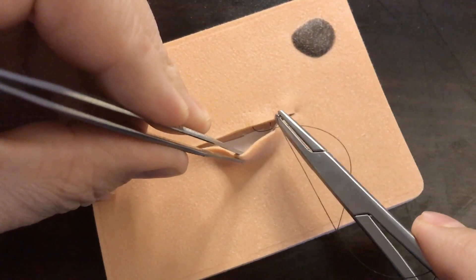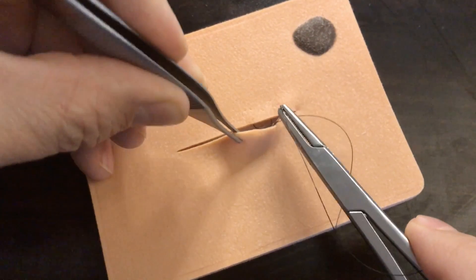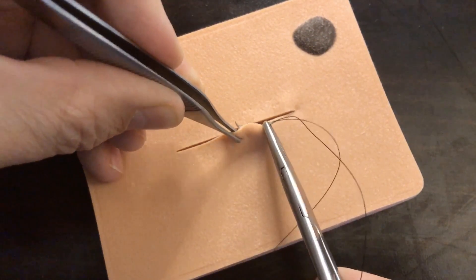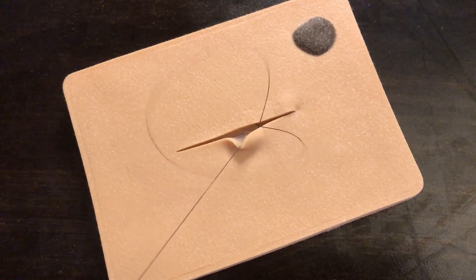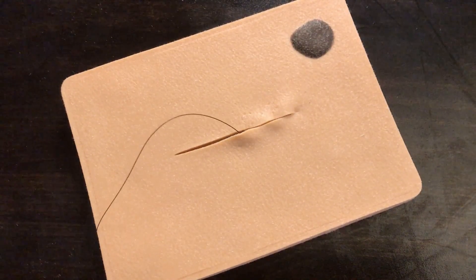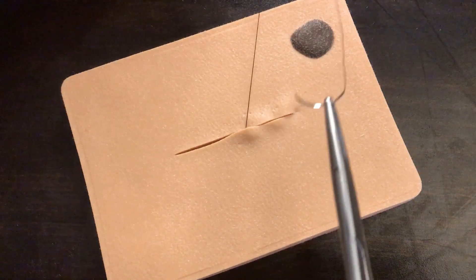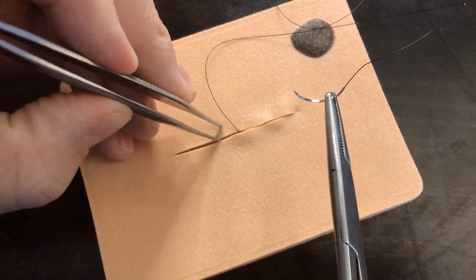Notice I've got a little bit of a buttonhole, so I'm going to stop. I'm going to back out. There we go. Again, back and forth.